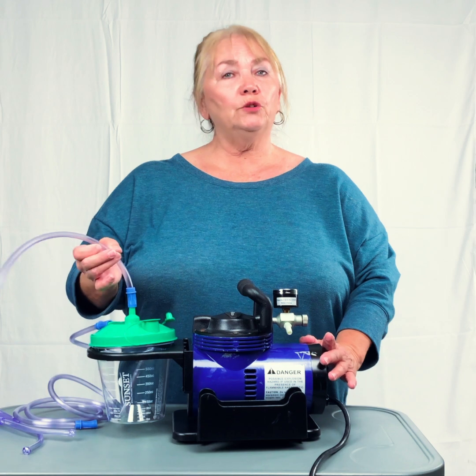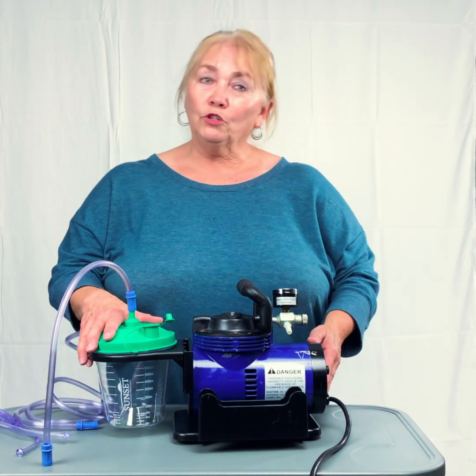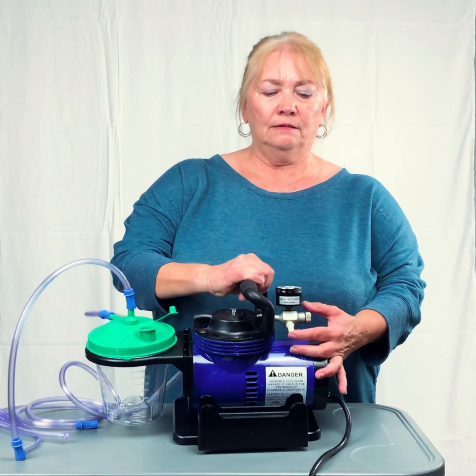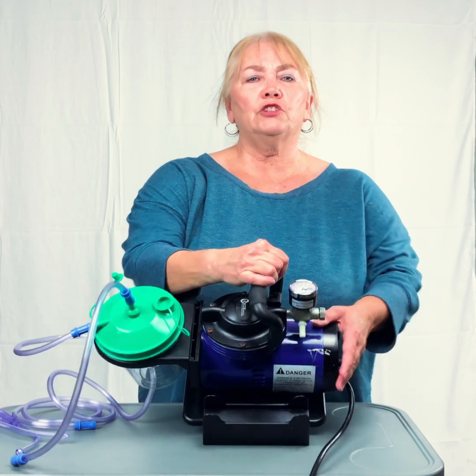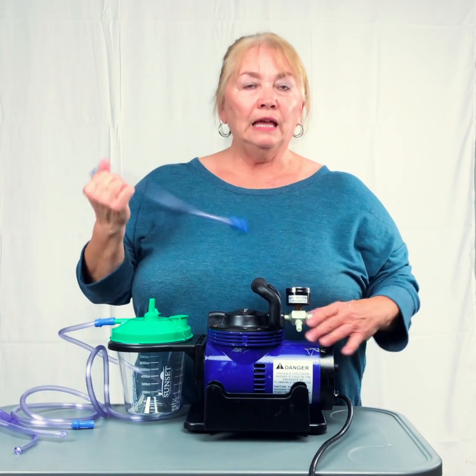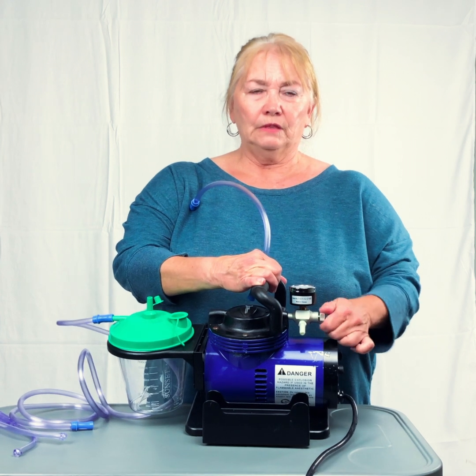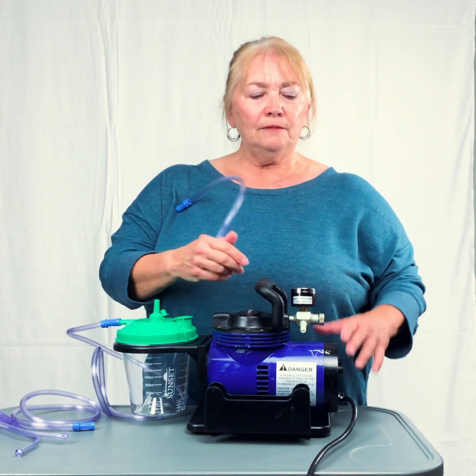So the first thing I'm going to do when we're troubleshooting, and of course I would have gloves on, or you would, is turn the machine on, disconnect your short tubing, and put your finger over the end, the connector. Is your gauge going up? Do you have suction? If you do, we know it's not the machine. If at this point you don't have suction, you need to make sure that your knob is turned all the way in. This regulates how much suction you have. So that's all the way in.